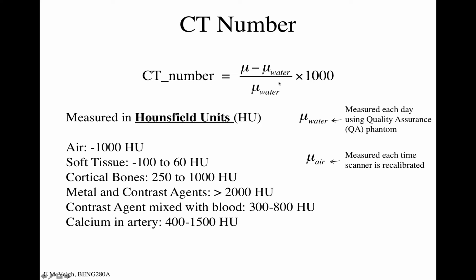I mean, you could just as well do this if you had a floating point picture, but in the early days of digital imagery, you needed values between minus 1,000 and 1,000. 8 bits would give you 256 levels, right? So 9 bits gives you 512, 10 bits gives you 1,000.